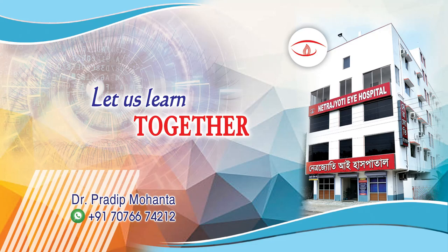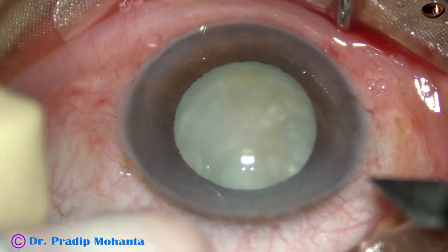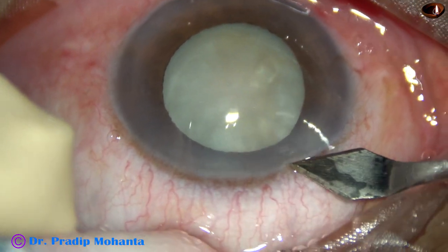Friends, welcome to my workplace at Rana Ghat, West Bengal, India. This is a white cataract. Let us observe this surgery.